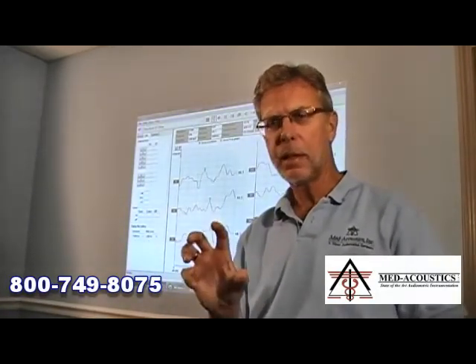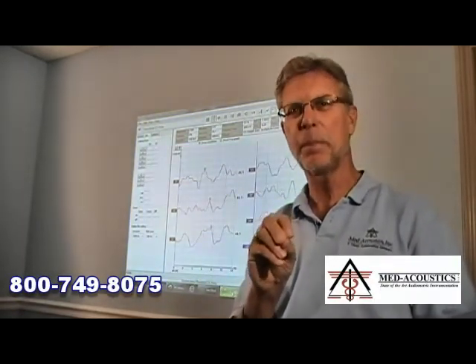The bottom line is it overcomes the physical problems of the cochlea in delivering an efficient evoked potential stimulus. And the problem is the timing of the cochlea. As you know, it takes longer for the low frequencies to travel the basilar membrane to get to where they're going to stimulate their part of the cochlea. It takes less time for mid-frequencies and much less time for high frequencies. Well, the chirp is timed so that the low frequencies actually arrive and start their journey to their place sooner than the mid-frequencies. And the mid-frequencies arrive and start their journey, timed just right and sooner than the high frequencies, so that they all arrive at the same time and fire at the same time.